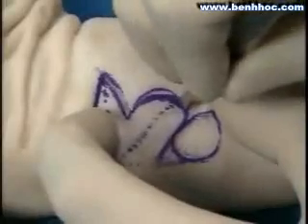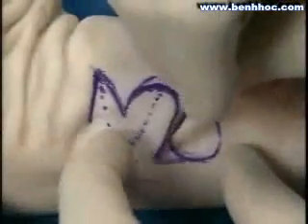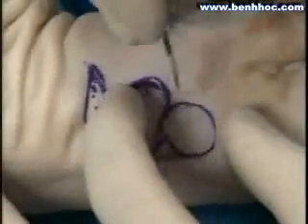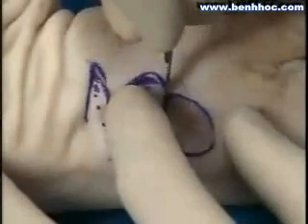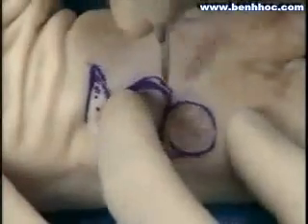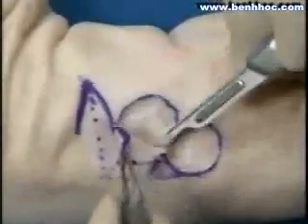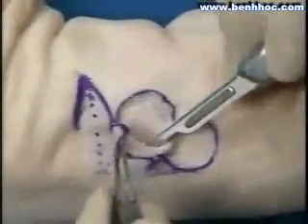Now a triangular portion is being removed as the remainder of the first flap is being undermined. The reason the angle or triangle needs to be removed at the apex of the first lesion is so that that first flap can be rotated into position.